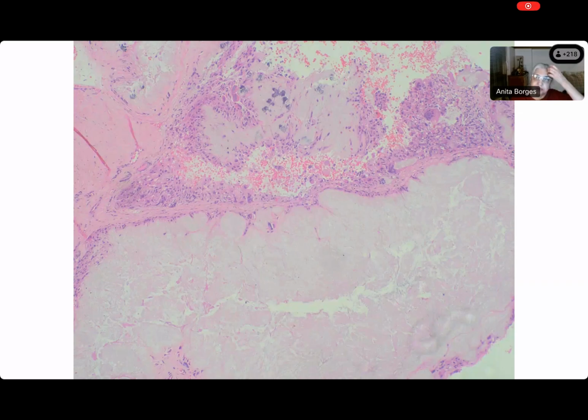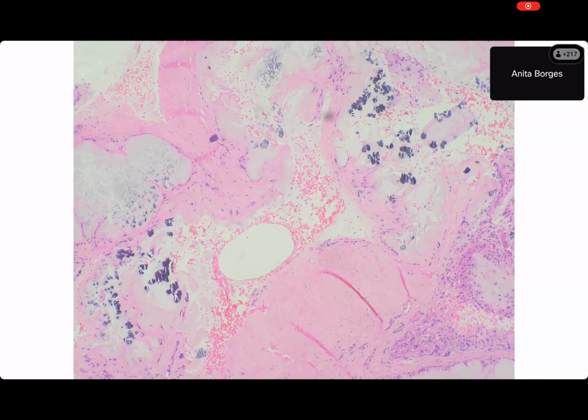Mansi, can you talk a little louder so that everybody can hear? Yes, there are osteoclastic giant cells. Ma'am, this nodule is surrounded by spindle cells along with giant cells. And there is also calcification. Yes, ma'am, here it also shows calcification. Okay. Can you say something about the calcification, Mansi? Ma'am, it is a coarse kind of calcification.